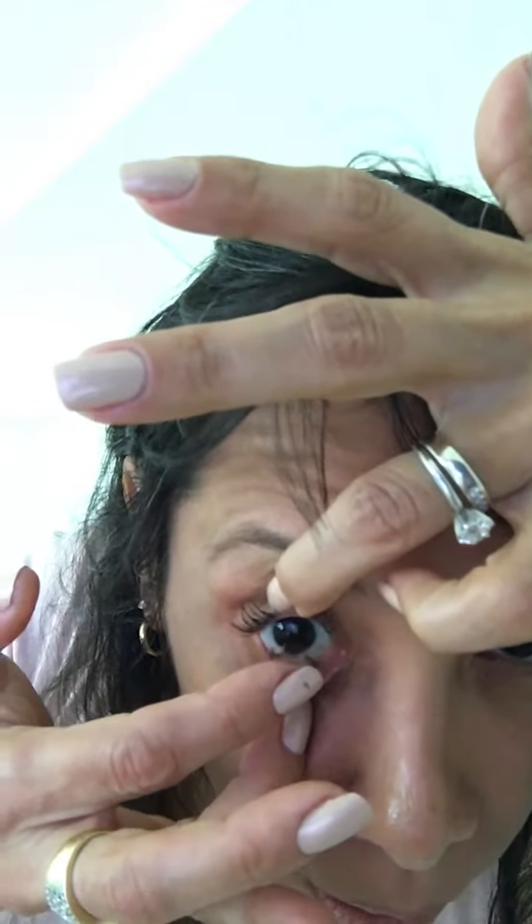Insert your contact lenses before applying makeup by lowering your gaze, lifting up and grabbing the upper lid, holding the lower lid, raising your eye, and placing it on the white part of the sclera. Then move your eye down, left, and right until the bubble disappears and the contact lens is in the eye.